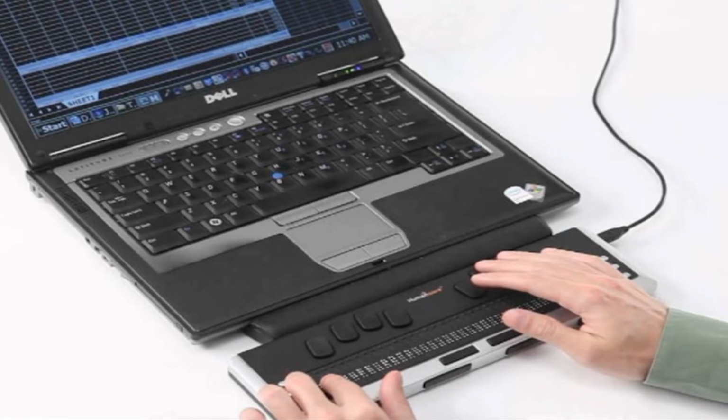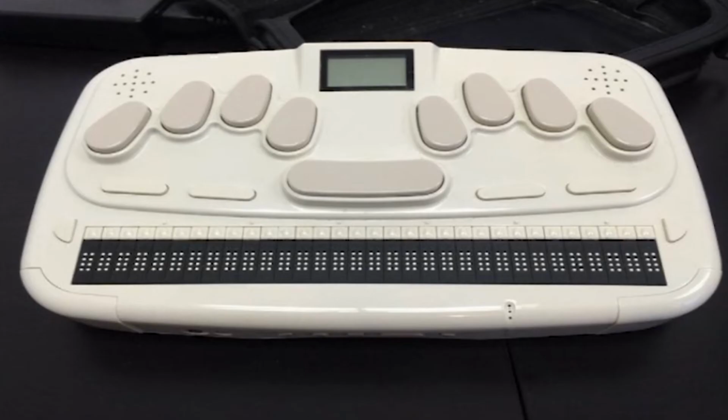Now let us see what is a Braille display. A Braille display is a device typically attachable to a computer keyboard that allows a blind person to read the contents of a display, one text line at a time, in the form of a line of Braille characters. Each Braille character consists of 6 or 8 movable pins in a rectangular array.